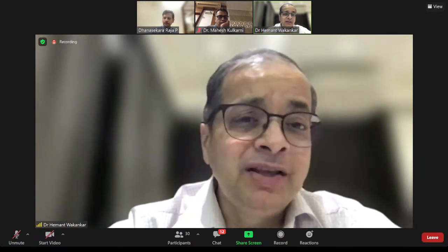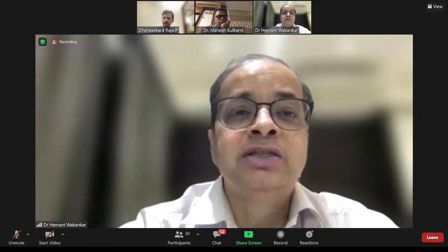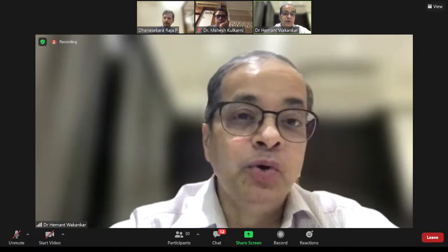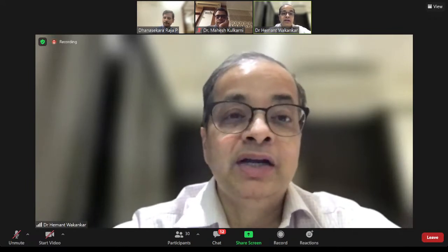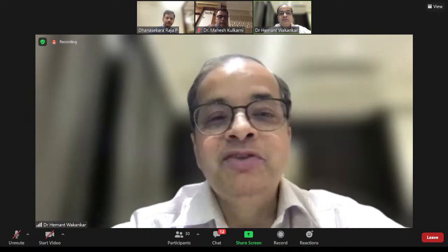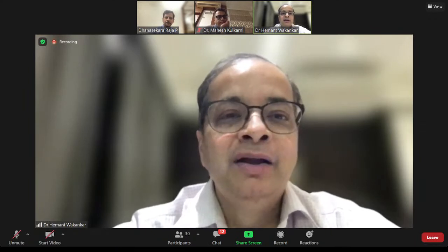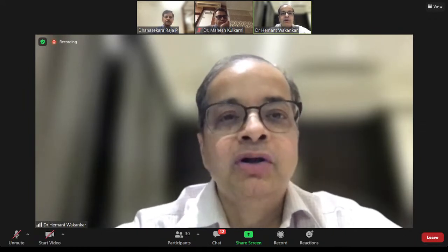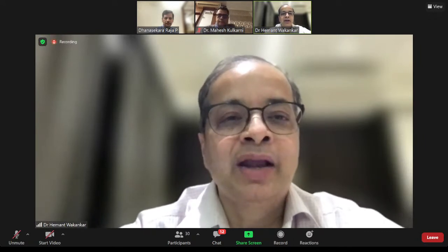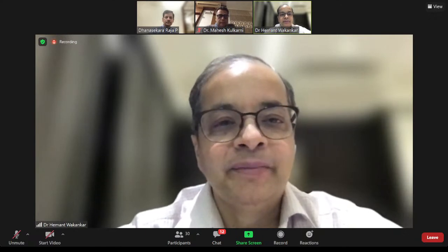Remember, PFC has stood the test of time. PFC is probably one of the longest serving prostheses next to IB2. I think probably more than IB2 now, because it was designed 35, 40 years back. So PFC has had its glory days and share. But today there are far better designs available. So in today's day and age, one can look at prostheses that are patella friendly. No question about it.